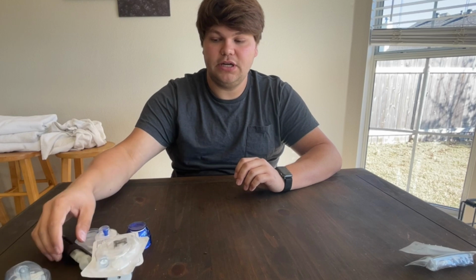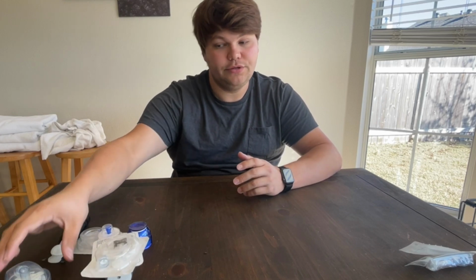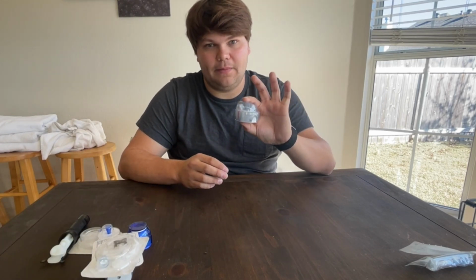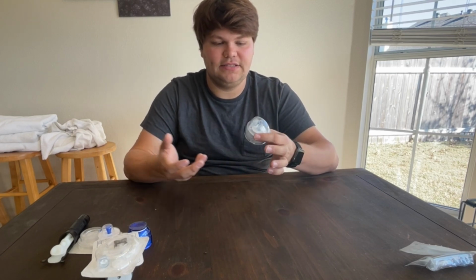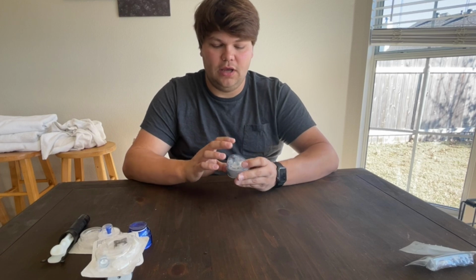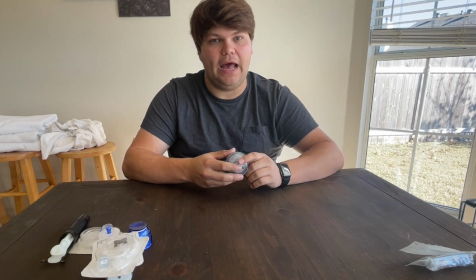All right, the most common, and the one that I've used the most, was the original Medtronic Mio. I like the Mio because everything is in here. It's all in the packaging. The inserter and tubing, all of it's together, and it's nice and compact.